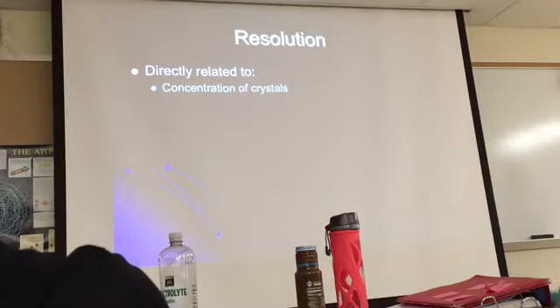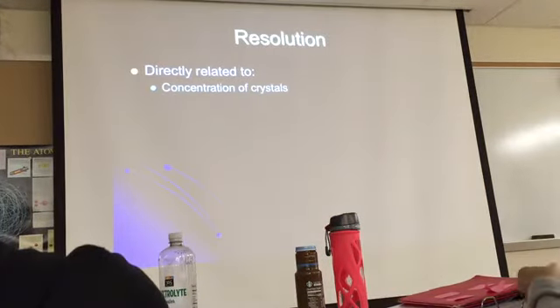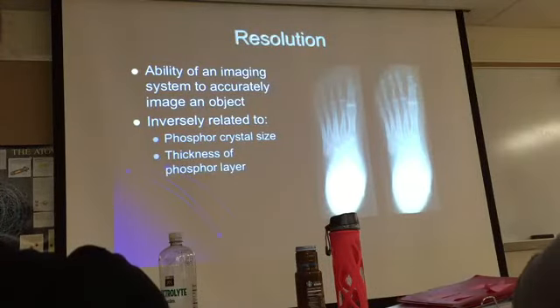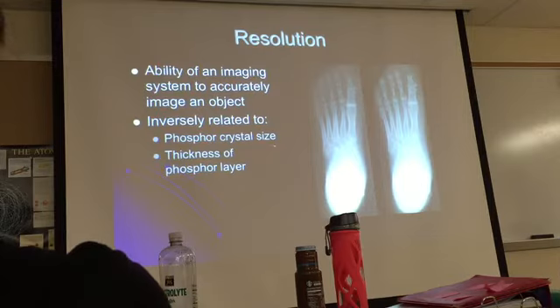So, resolution is related to more than what I have said here. What did I say about phosphor crystal size? The bigger the phosphor crystal size, the less resolution you get. The thicker the layer, the worse it gets.